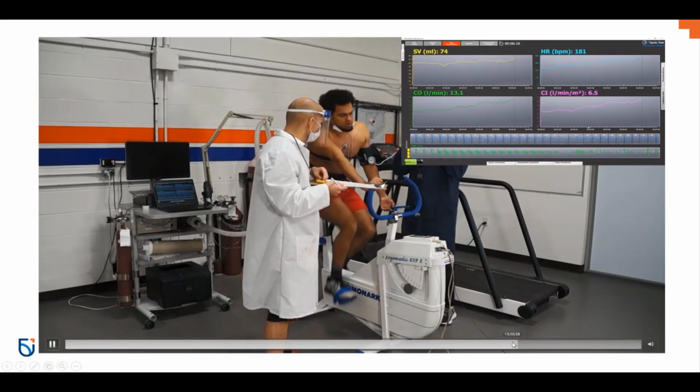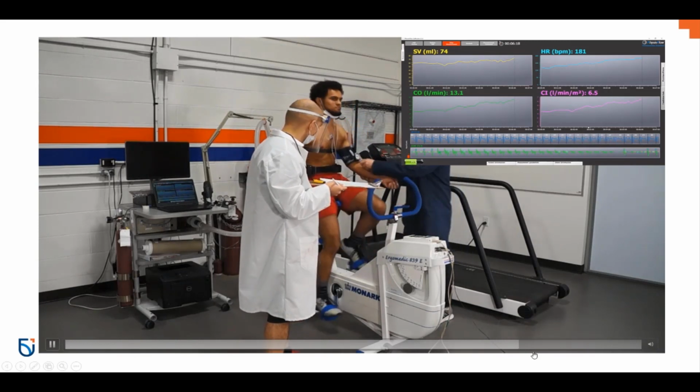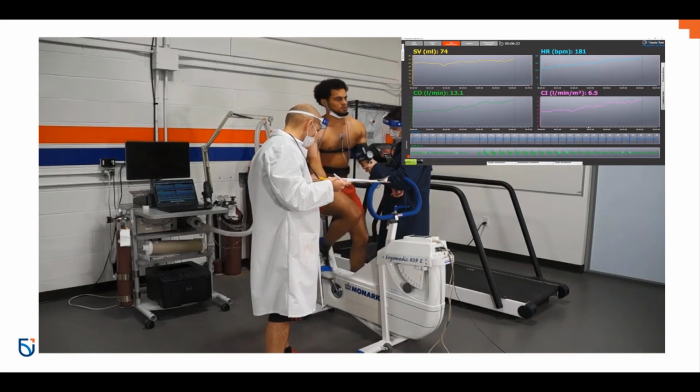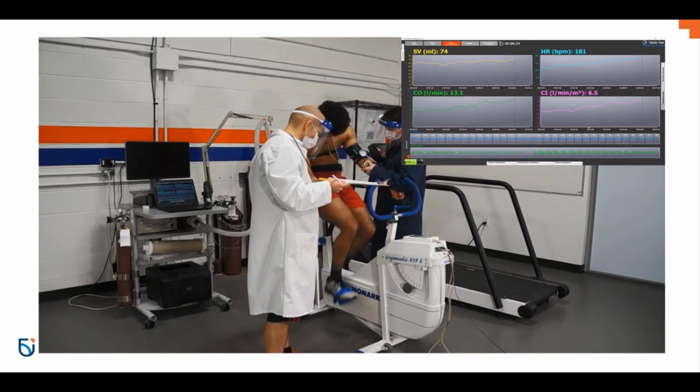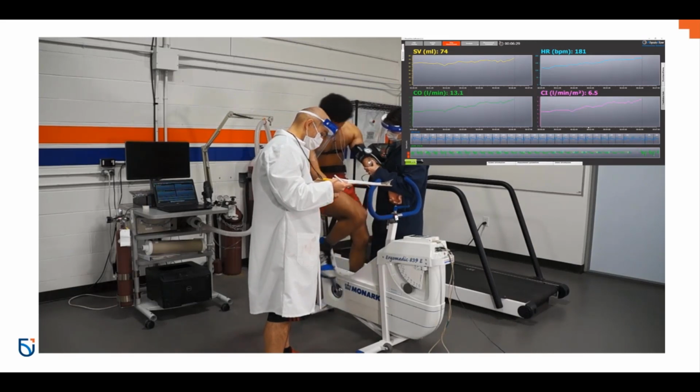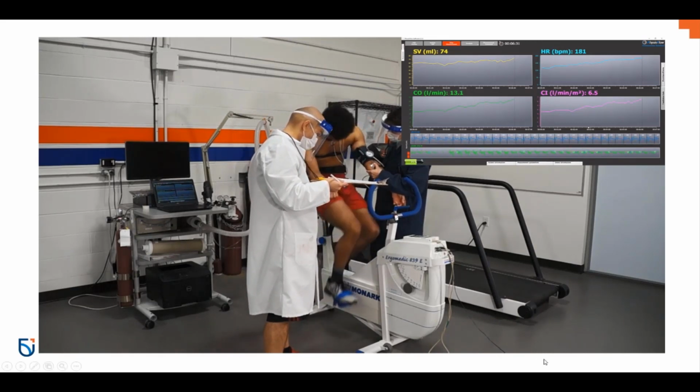But Justin's cycling here at 180 watts. We're getting towards the end of that second stage. We're going to take our measurements, and again, this is where it gets really tough at the end of each stage to get the participant to comply with your measures. You can see his head down, he's really trying to grind those legs.